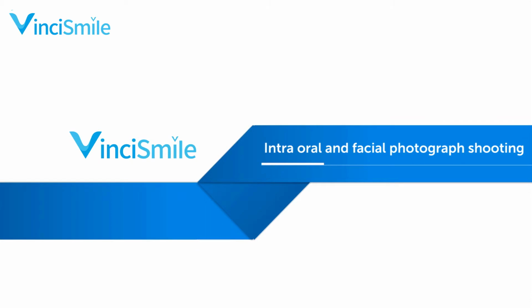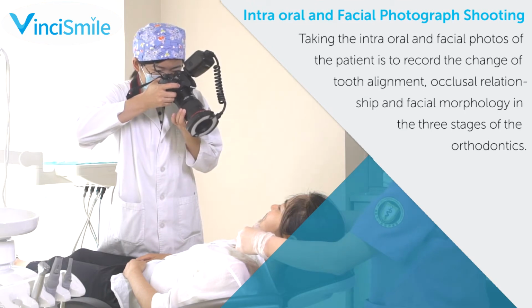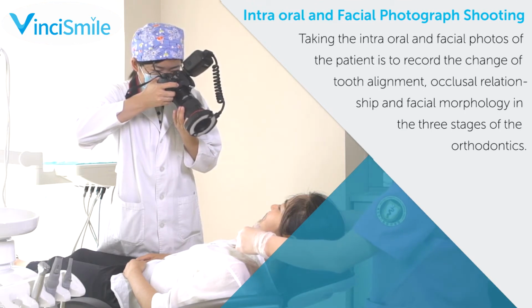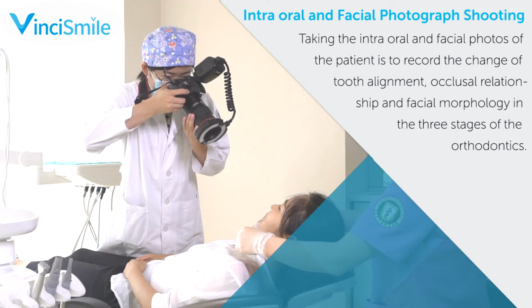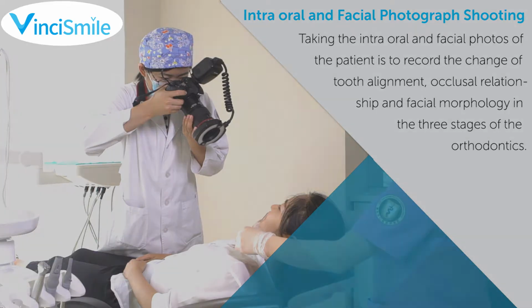Intra-oral and facial photograph shooting. Taking the intra-oral and facial photos of the patients is to record a change of tooth alignment, occlusal relationship, and facial morphology in the 3 stages of the orthodontics.